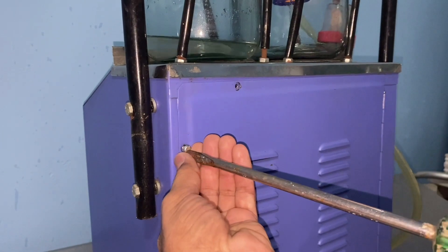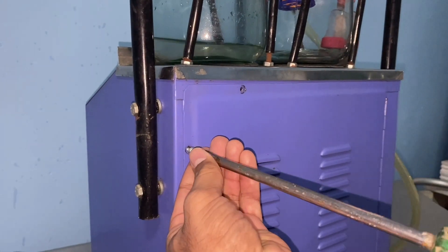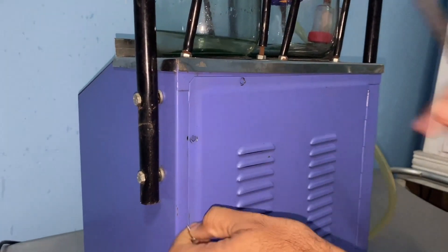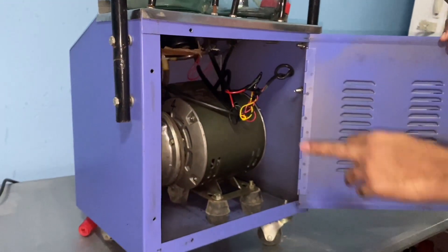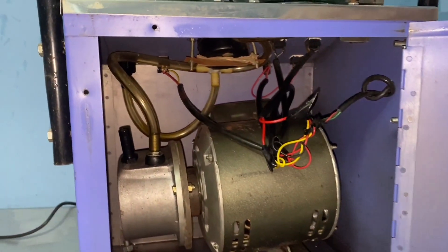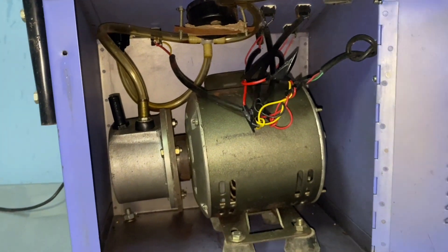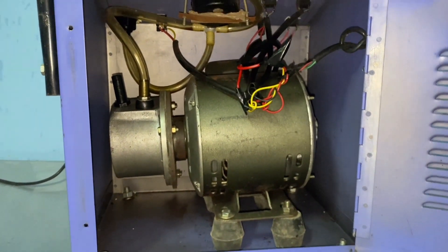When there is minimal suction, you can open the machine by loosening a few screws on the back side. This is the suction machine which needs oil replacement.